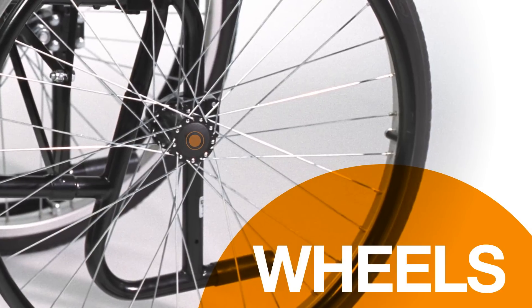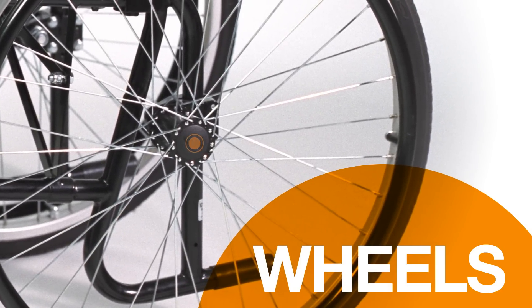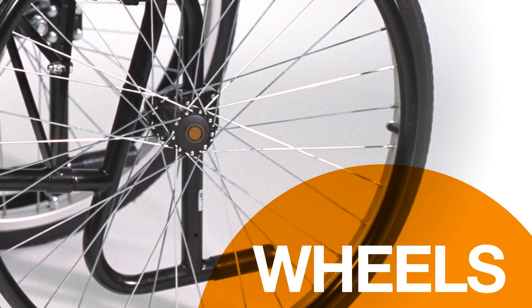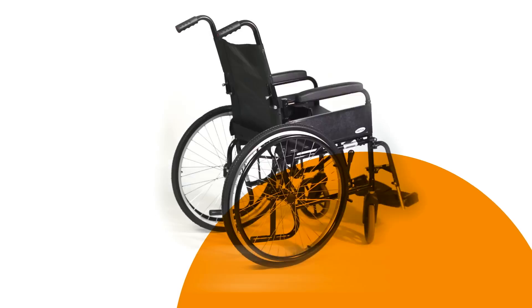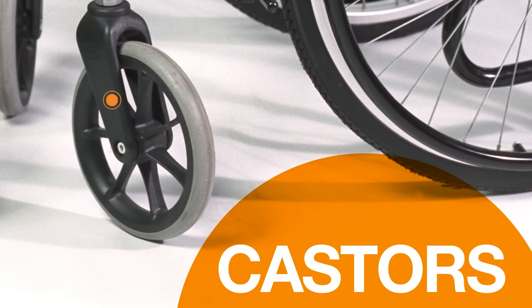The wheels come in different sizes with wire or plastic spokes, and some have quick releases to make the chair lighter and smaller for transporting. The casters swivel as the chair is turned, making it easier to steer.